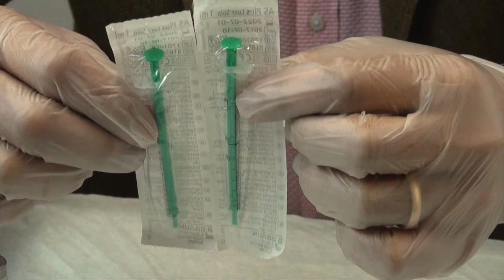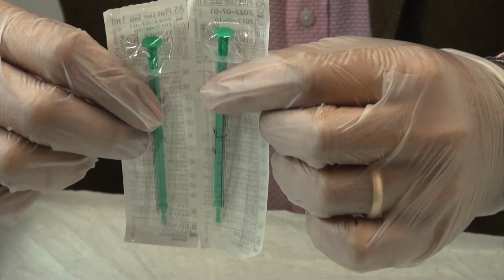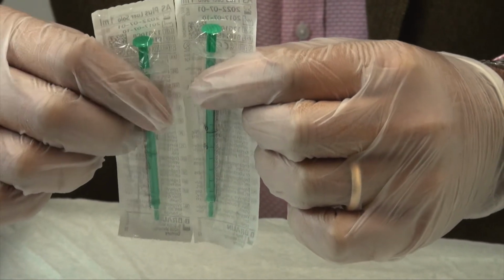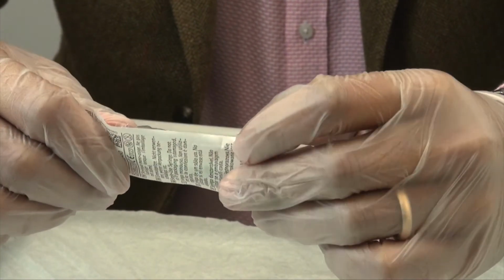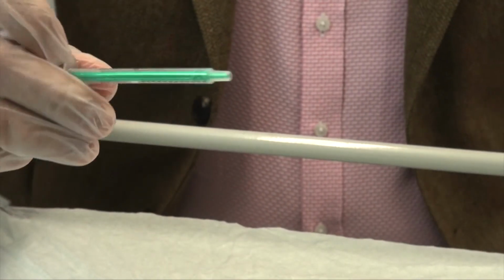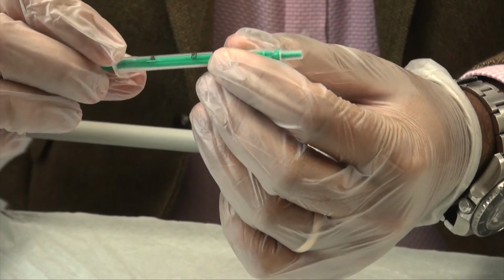Now, Azzalure comes packaged with these nice green syringes. And these are specially calibrated syringes to make the measurement of Speywood units a lot easier. So if you use the syringe that comes with the Azzalure vials, it is in fact a 1 ml syringe.